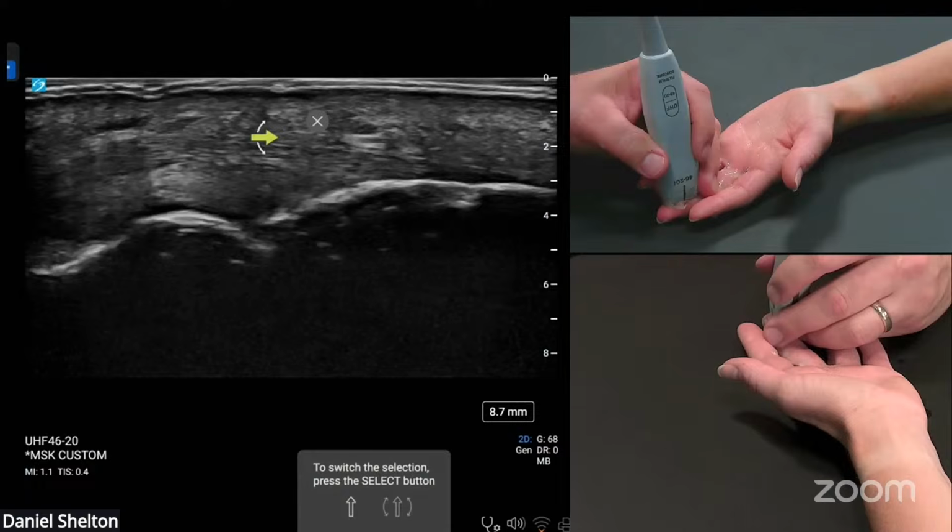We do have a question that just came in. What is the orientation of the needle when doing thumb A1 pulley injection? So a thumb A1 pulley. So we will have a procedure series later next year, basically where we go over injections. We'll have guest speakers, guest physicians in that case, on how much of a medication to include, volumes. But if you were to do, which I don't believe our live scan, we really got a chance to stick with, let's switch hands.